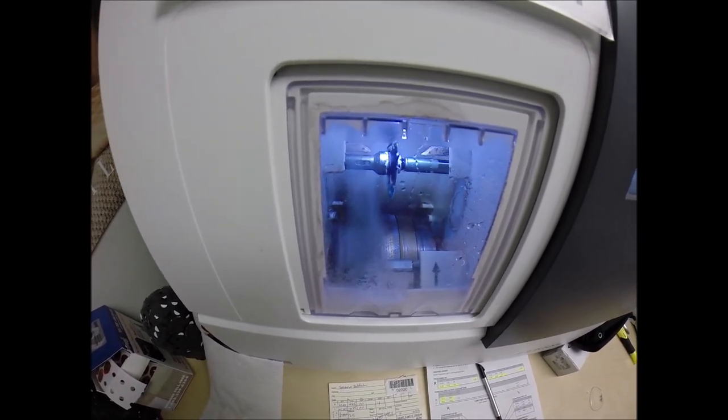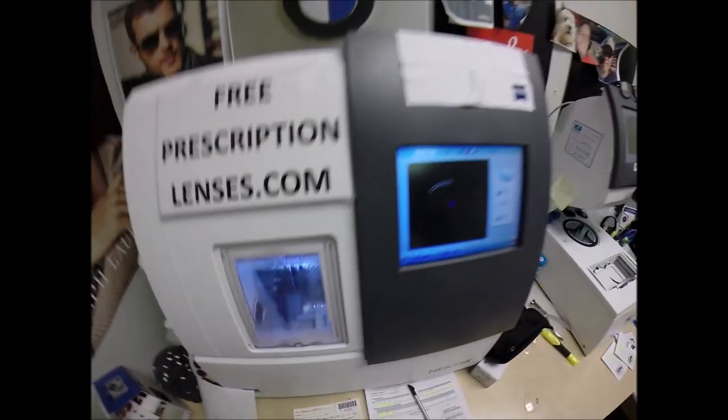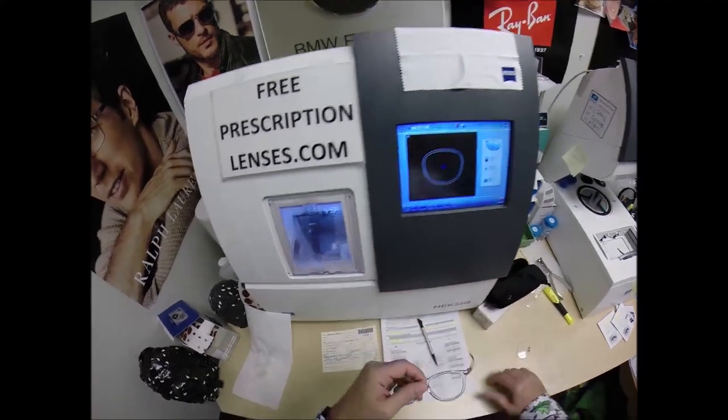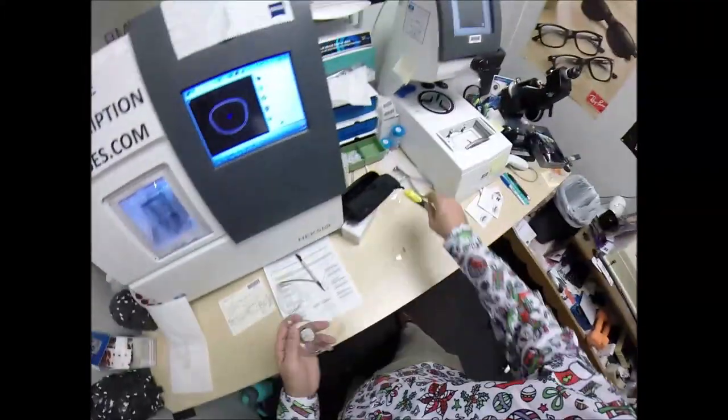It's going to trace the left side this time, making sure the lens is large enough. You can see it going around tracing the shape of the left lens. I come down here for final inspection — turn the axis wheel to 137, place it above the black dot.